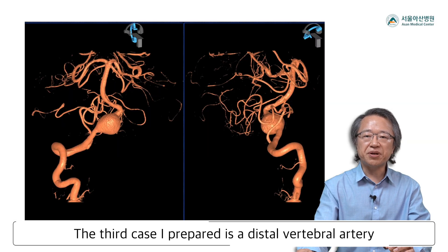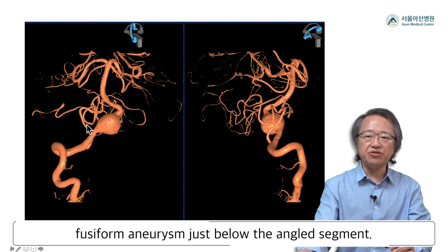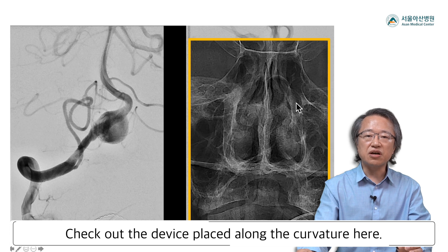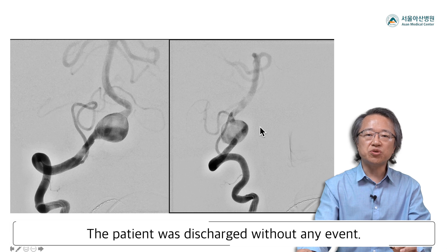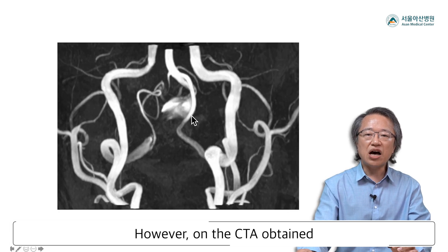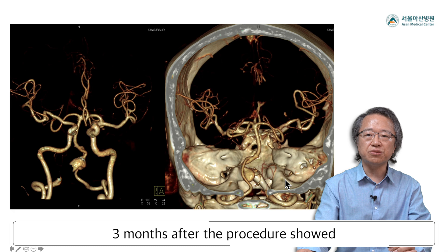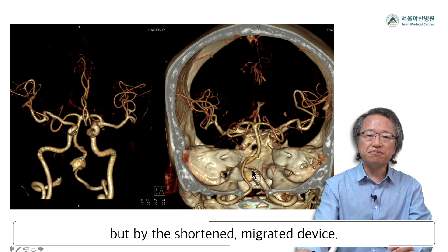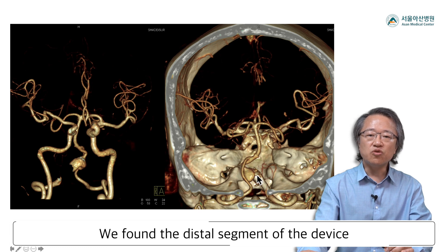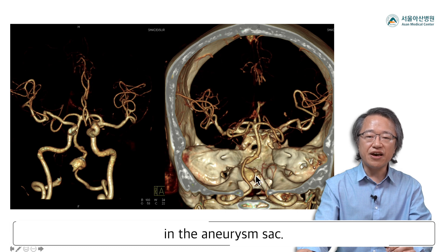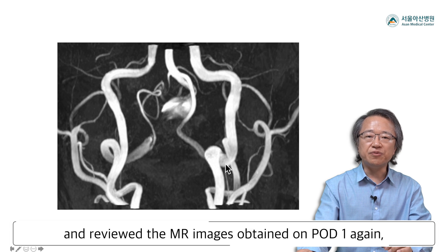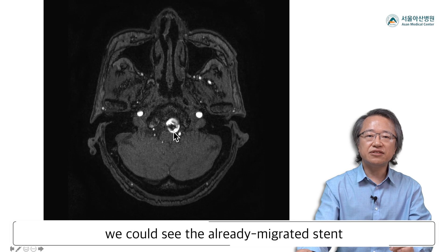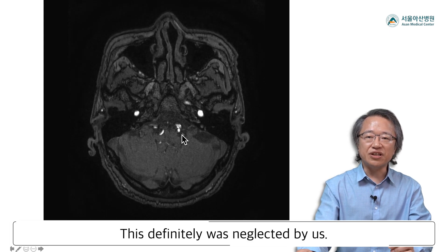The third case is a vertebral artery fusiform aneurysm, just below the angled segment. Flow diversion was done — check out the device placed along the curvature. DSA finding was acceptable and the patient was discharged without any event. However, CTA obtained 3 months after the procedure showed persistent aneurysm filling. We were frightened — not by the poor occlusion, but by the shortened, migrated device. We found the distal segment of the device in the aneurysm sac. Shamefully, when we went back and reviewed the MR images obtained on postoperative day 1, we could see the already-migrated stent on the source images. This was definitely neglected by us.